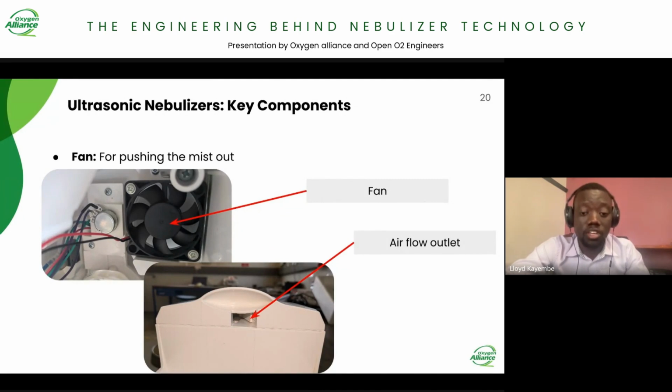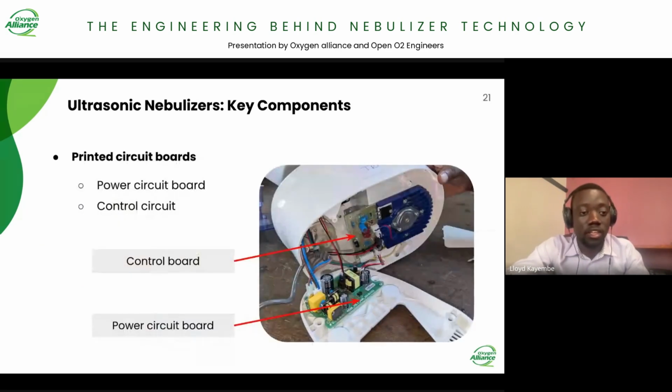Some models don't have a fan. They just rely on the patient's inhalation to draw the mist from the nebulization chamber. So just take note of this.